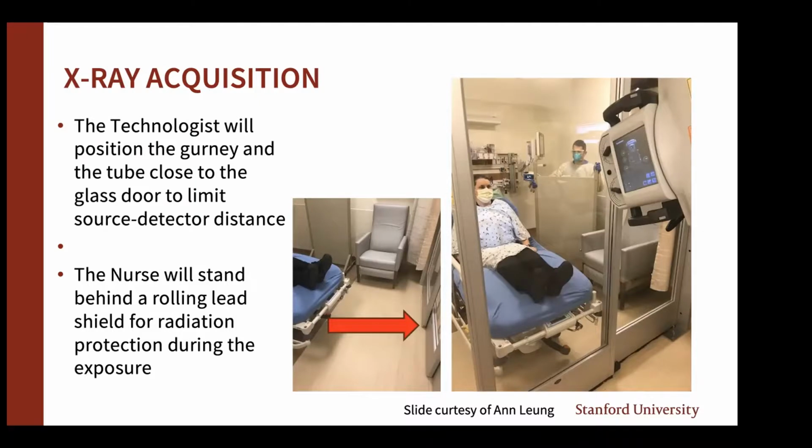Another question I've received in the past was, is this possible with prone patients? Those are patients that have a more severe case of COVID, and it doesn't work for that either. In those cases, you do still have to go in the room. Right. In terms of positioning the patient, is there a significant amount of difficulty bringing the tube outside, in terms of getting a good oblique incidence? I guess you're just a little bit further away. Yeah, it's a little bit of a different workflow. I think a lot of times with the portables, they're really doing more of an over-table type shot.